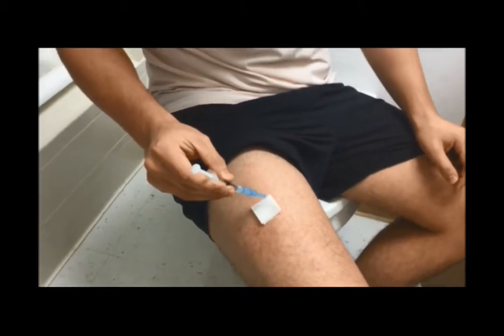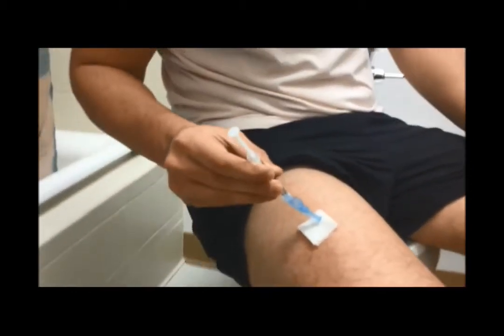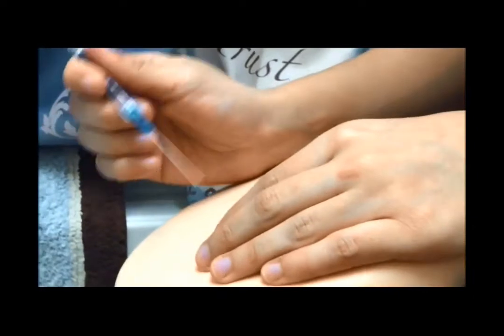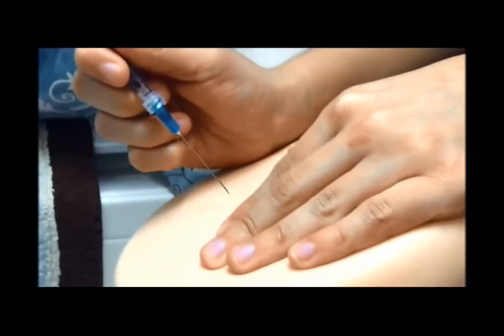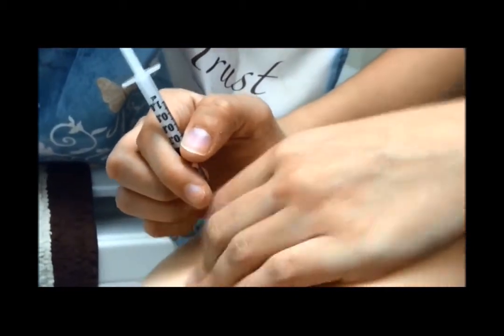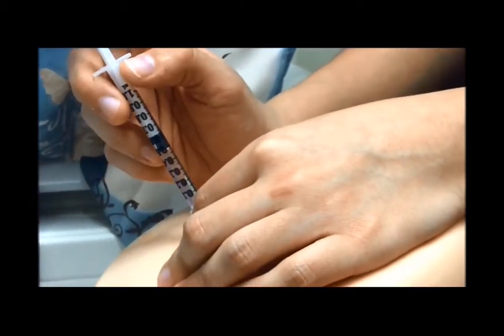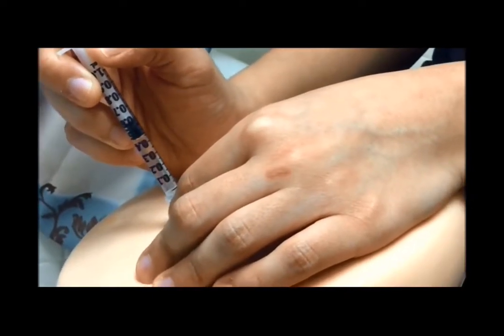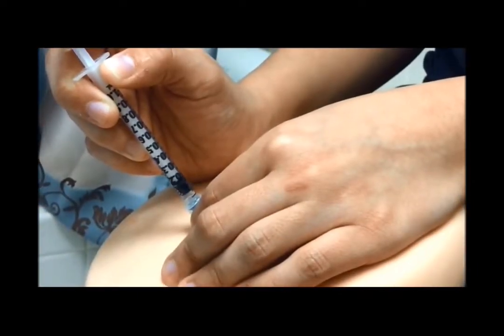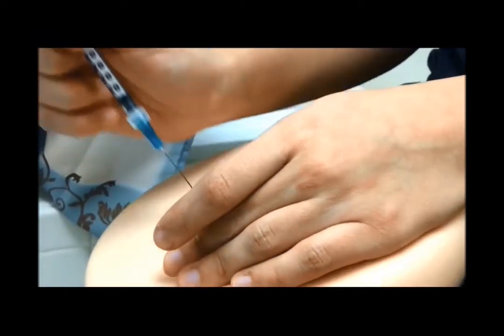You will then hold your filled syringe like a pencil in your dominant hand and uncap the needle in a fluid motion. Grip your leg muscle with your non-dominant hand and quickly puncture the skin at a 90-degree angle from the surface. Move one hand to hold the syringe in place at the base and use your other hand to push the medication. Another tip, injecting quickly hurts less than going slow. Imagine the quickness and force you use to throw a dart and stick with confidence. You will then quickly remove the needle and apply pressure to the site with gauze or a bandage. Do not rub it.